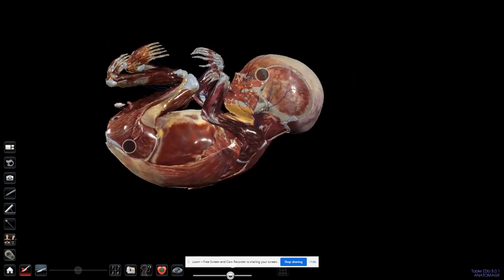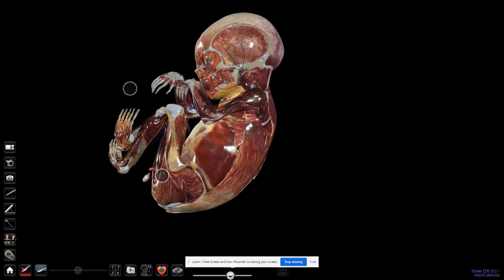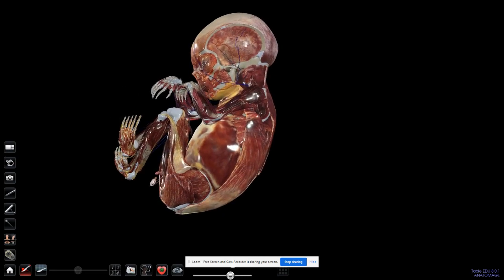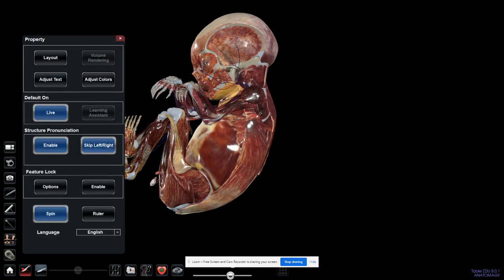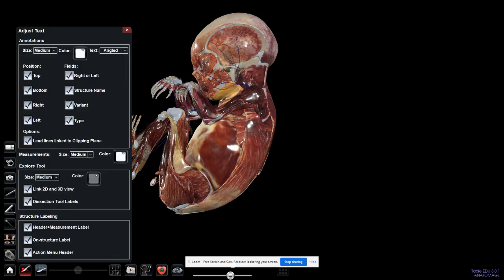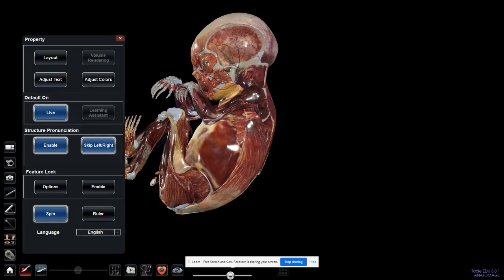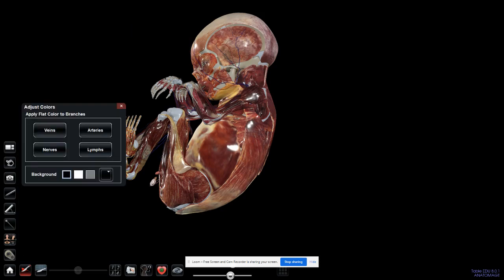I can rotate, and then we start off always by the settings—just this button here—in order to change the layout, change the text if I want, or adjust the colors of the veins, arteries, and nerves.